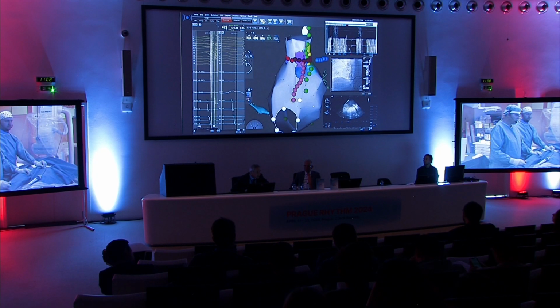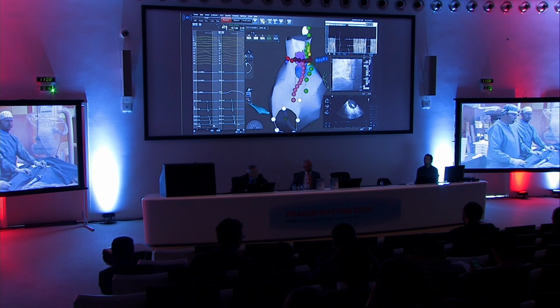You can explant the pacemaker. That's an issue, and we have some patients who already had the pacemaker explanted, because if somebody is young and somebody implants a pacemaker, which is not rare, if you only implant pacemakers, you treat everything with implantation of a pacemaker. And if the patient continues to have syncopes because of neurovagal origin, then you do this neuroablation and you can explant the pacemaker, which for the patient is a tremendous difference because of all the potential complications of the leads and exchanges of the box.